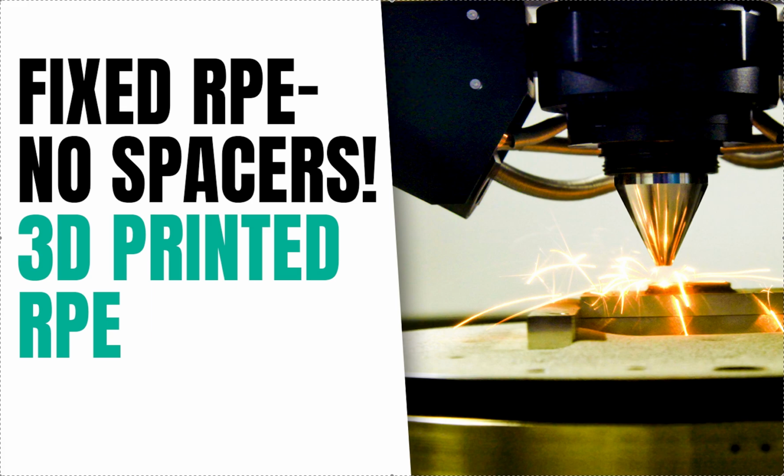There's also the option of doing a Schwartz, which works fine as long as you're not in mixed dentition, changing dentition, and as long as you're compliant. Don't always have great compliance with that. But now we've got fixed RPE, no spacers, 3D printed RPEs.